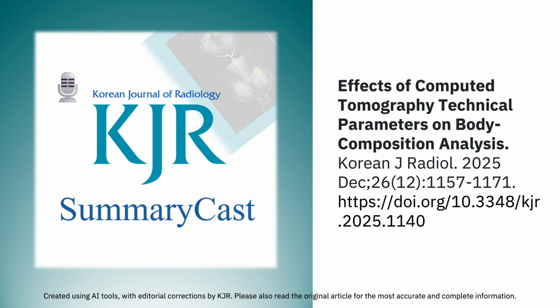And its effect on BCA is basically unknown at this point. Exactly. It's an area that needs urgent investigation. What about another fundamental reconstruction parameter, slice thickness? Another source of variability. Thinner slices give you better spatial resolution, but also more noise. The effect on BCA seems to be mixed.